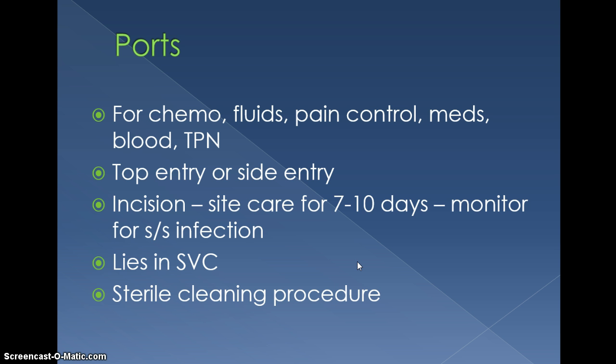Afterwards, you have to remind the patient that the device is in place and that he needs to carry something with him that tells the specific care protocols, the serial number, and the model of the implanted port. So if he has to have any other kind of procedures, everyone's aware of what he has as his central venous access device.